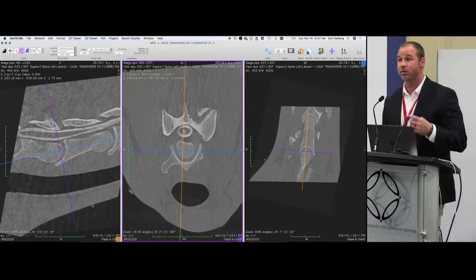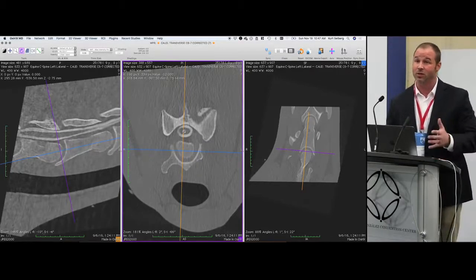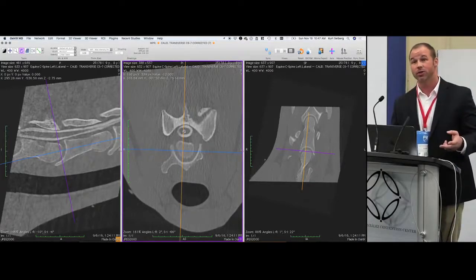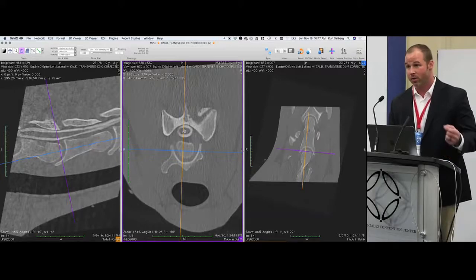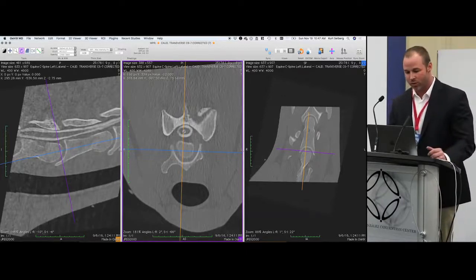So it can be bony stenosis, we can have soft tissue, and more recently we had a nice soft tissue compression, a lateral compression from the capsule coming in, and so that might change what you're going to do clinically. So is this going to respond to intra-articular medication, or are we going to have to do something more drastic in a horse that has a stenotic or dynamic compression, so spinal cord or spinal canal fusion kind of thing, versus intra-articular medication, to see if we can get that horse more comfortable.